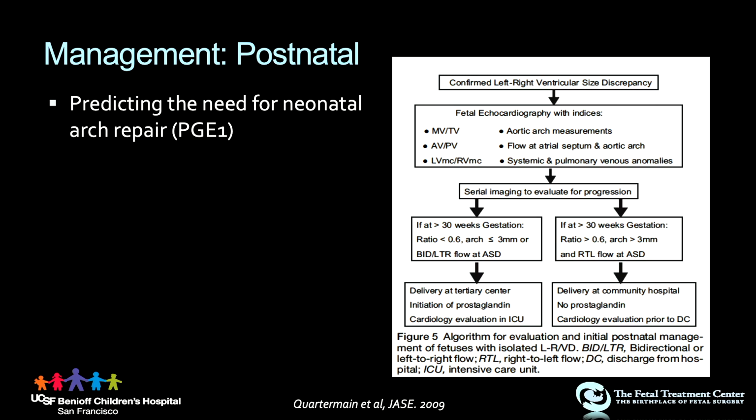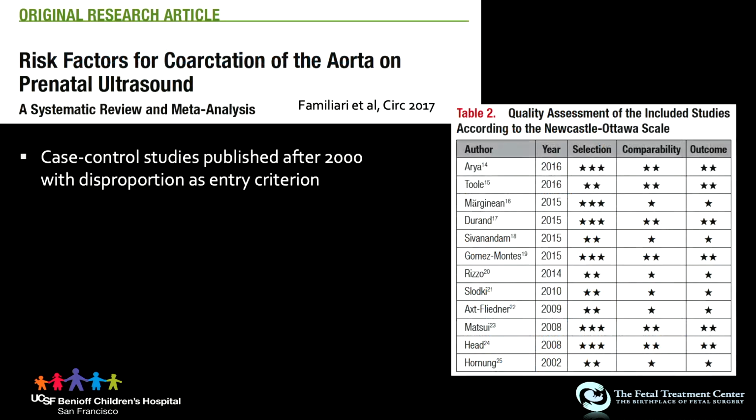So more recently, there was another paper published. It was a really large systematic review and meta-analysis that pulled together all of the studies on diagnosis of coarctation of the aorta on prenatal ultrasound. Of all the papers they looked at, this comprised over 900 fetuses, of which about 30% ended up having a true positive coarctation of the aorta.